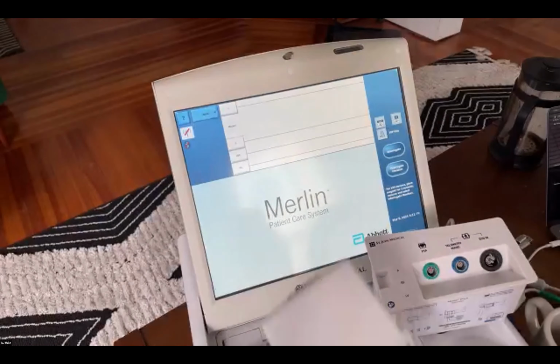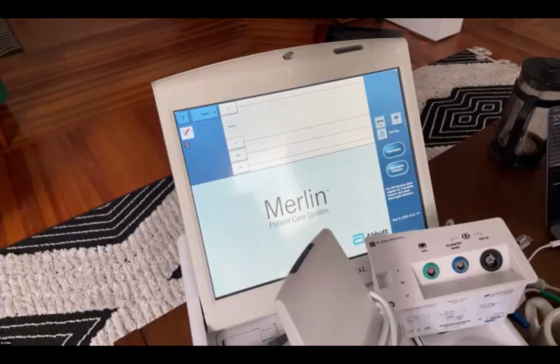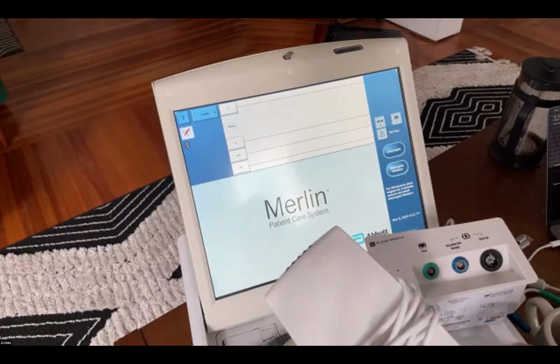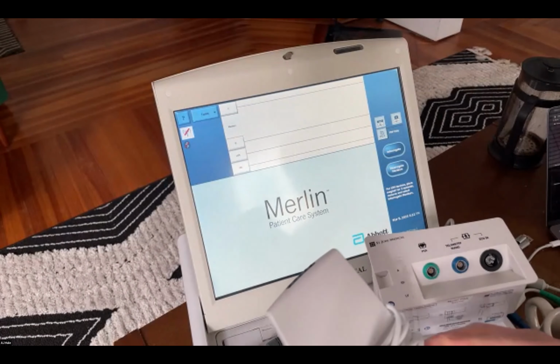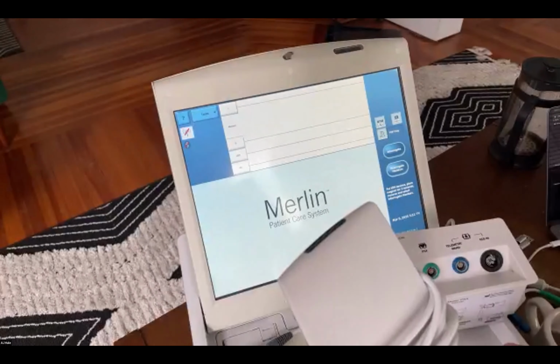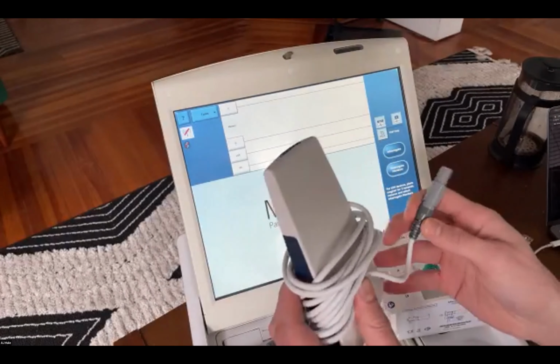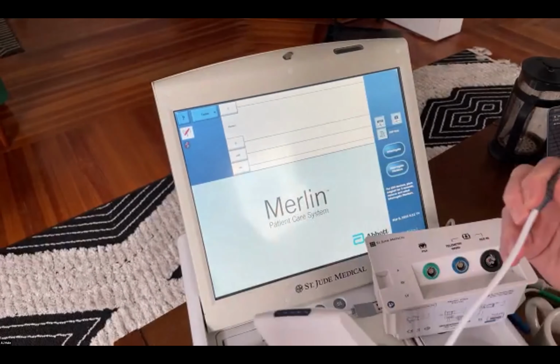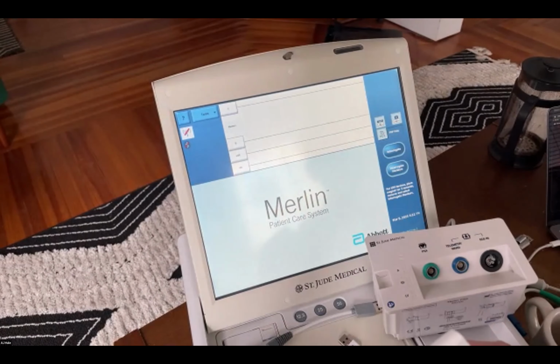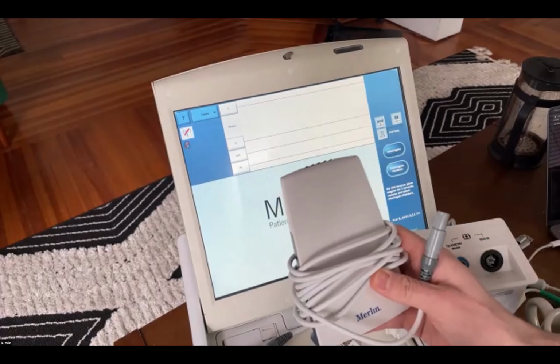You also have what's called an RF telemetry wand. So all of our older devices, for the most part, that have remote telemetry options used RF. The newer ones use Bluetooth, and then some are induction only. RF has a higher transmission speed than inductive. So if you have the ability to use one of these, I'd recommend using it. Just keep in mind that pacemakers only have about an hour of RF telemetry a month. Defibrillators have about 3 hours. So if you run out of telemetry, you lose the ability to communicate, and you'll have to switch back to inductive.